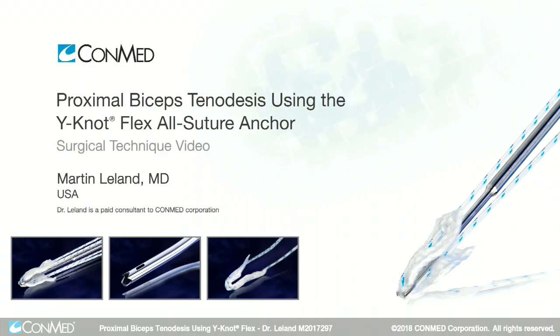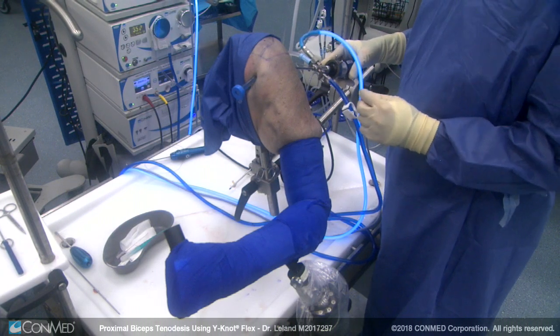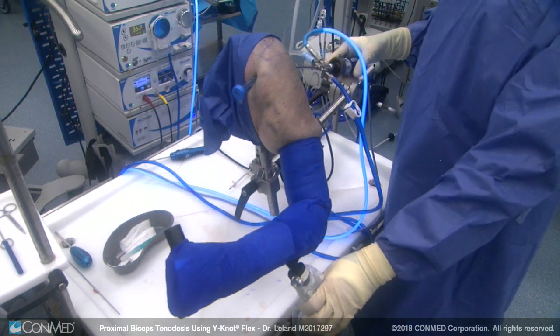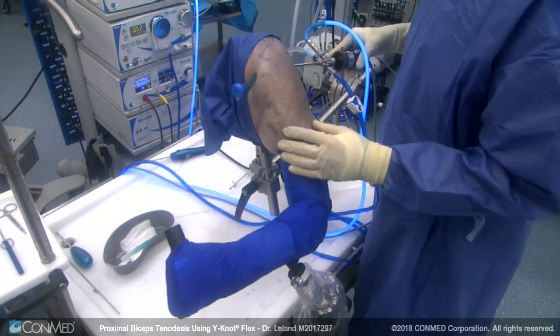Today we're going to be demonstrating an all-arthroscopic proximal biceps tenodesis using a Y-Knot for anatomic in situ fixation of the biceps tendon. We're using the assist arm to position and hold the arm throughout the procedure, with the scope in a posterior portal and our anterior cannula in place.